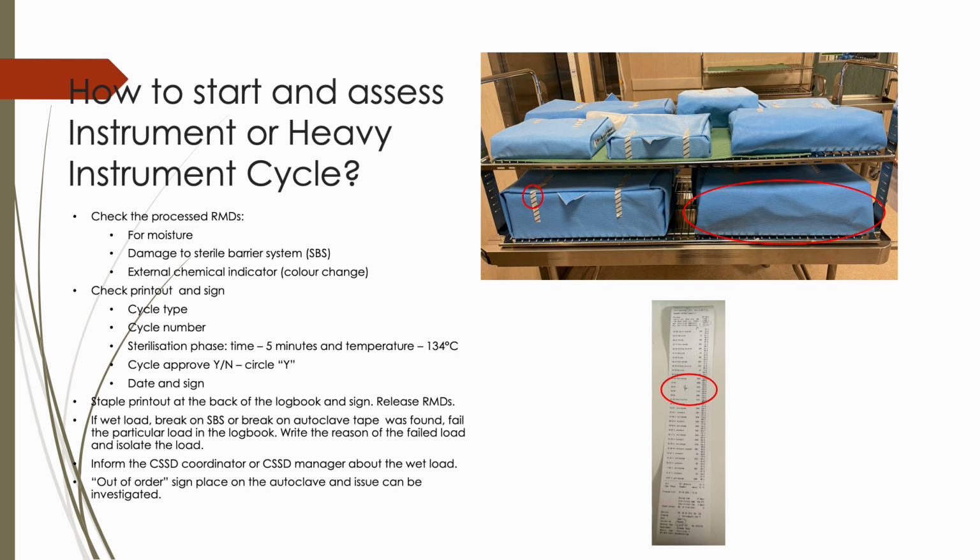When it meets the cycle parameters, you can now approve the cycle and sign and date the printout. Now, record the printout and sign the logbook. Now your sterilized RMDs, or reusable medical devices, are ready for release.